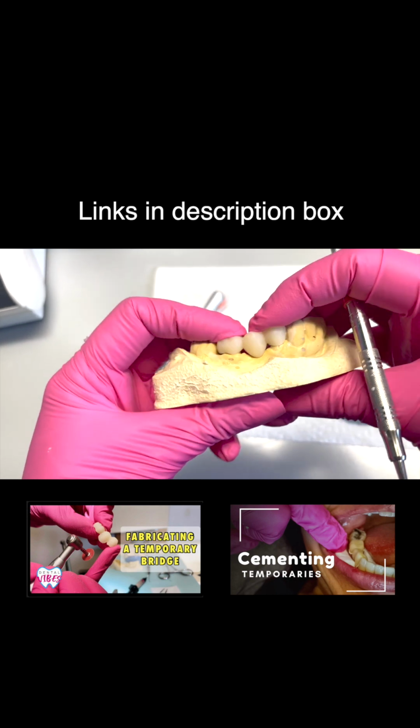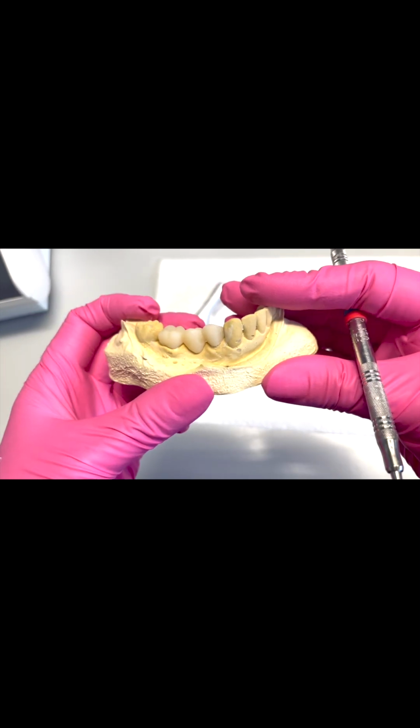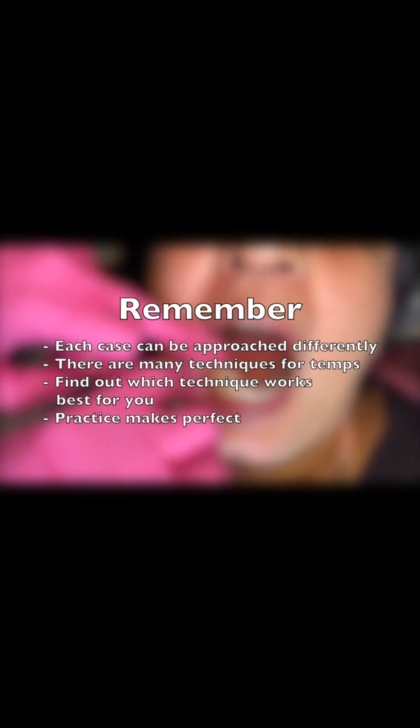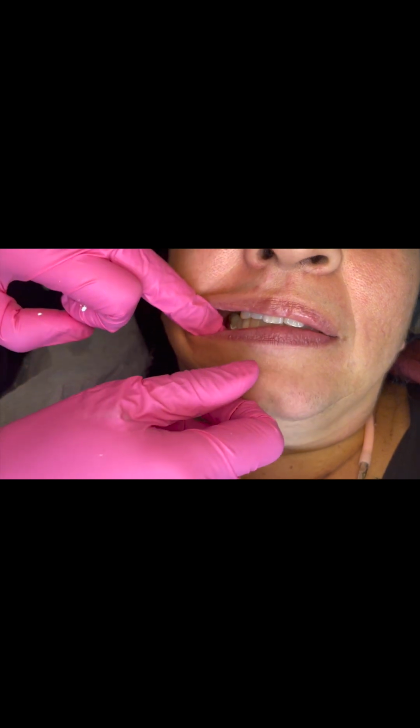the description box. Before I show you how to create a quick index, I will show you two other options because the way you approach each case of temporary bridges will vary depending on the amount of time that you have available and the scheduling of the patient's appointments.